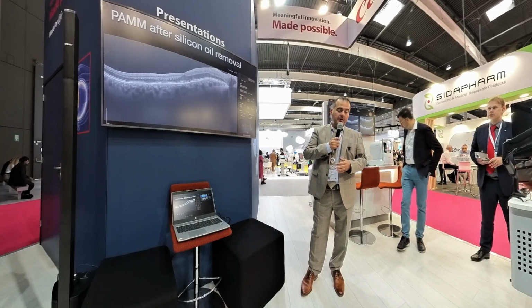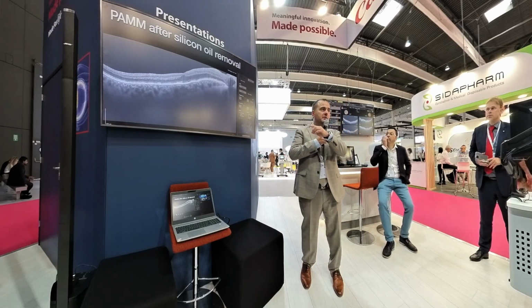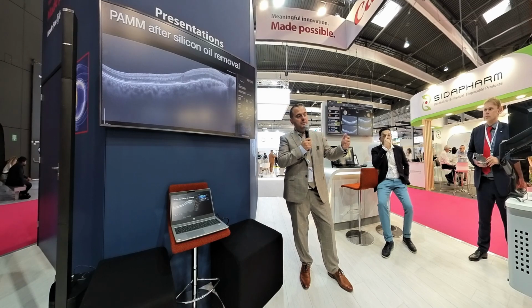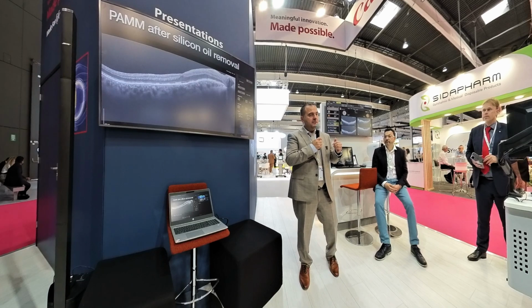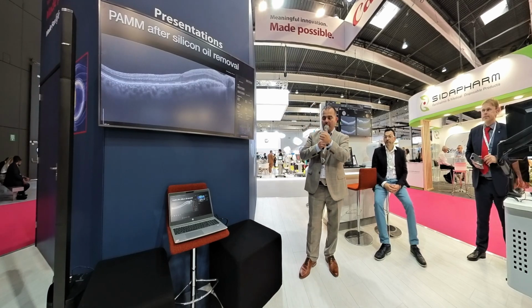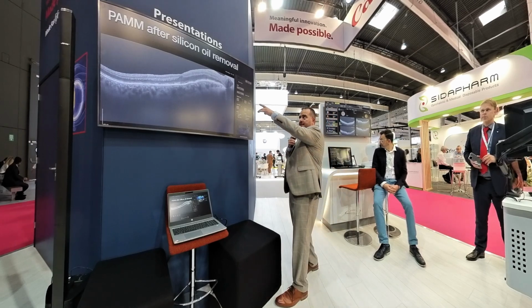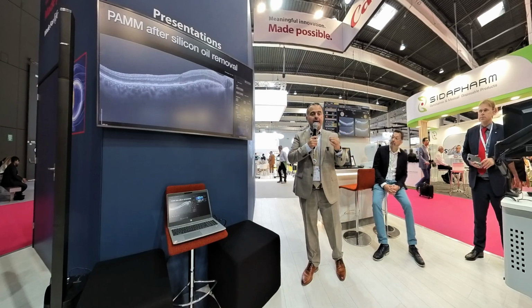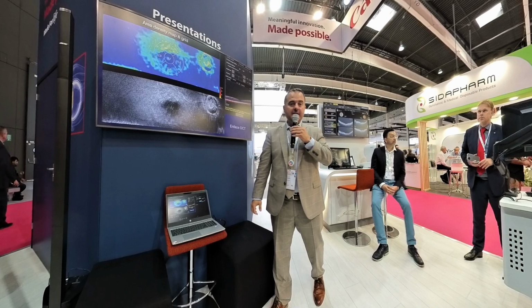And without such level of resolution, we cannot be certain that this is the diagnosis, and we might not have an explanation about why the patient doesn't see. And vice versa, when we can show where the problem is, here obviously the absence of the plexiform layer, we can point to a reason why the patient doesn't see.